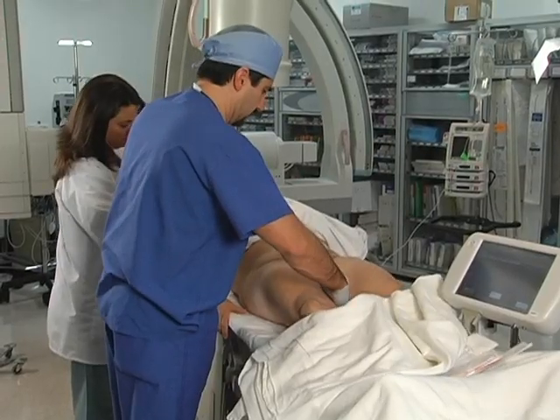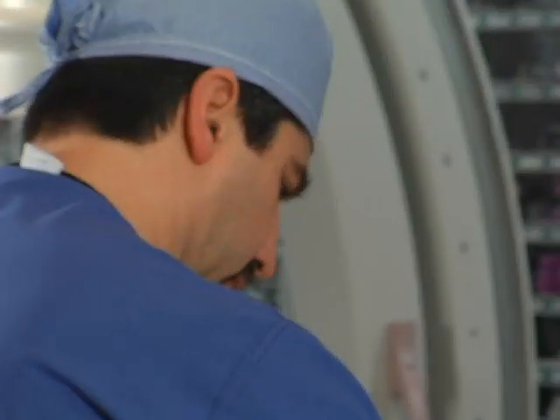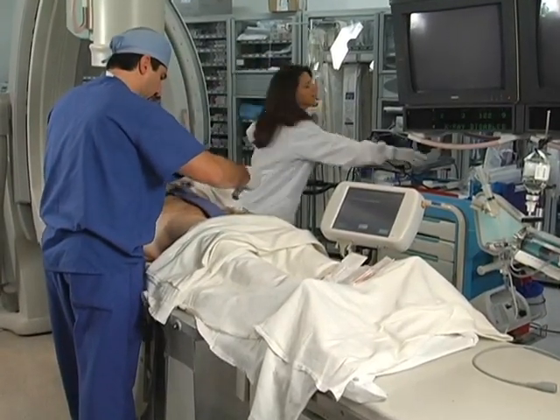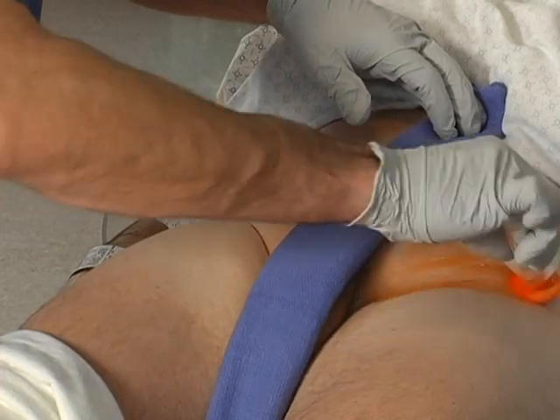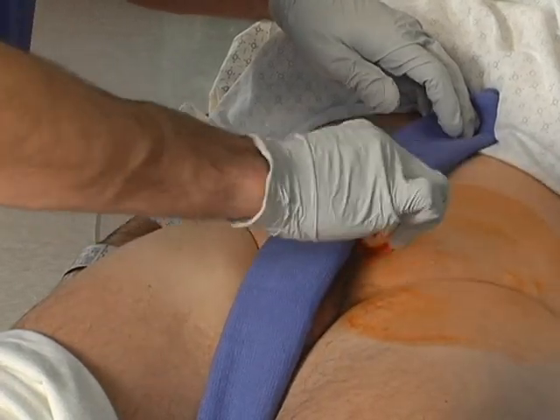The groin preparation is then performed for those patients having femoral access. At this time, if radial access was planned, both femoral and radial approaches would be prepared. The patient's hair is clipped. Chloroprep solution is then applied to both groins, and finally, draping will occur shortly thereafter.